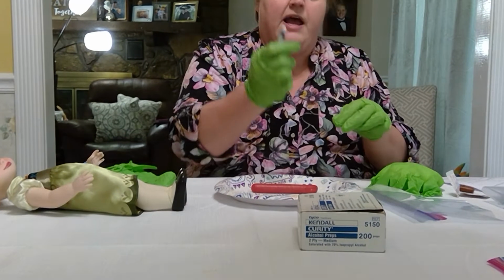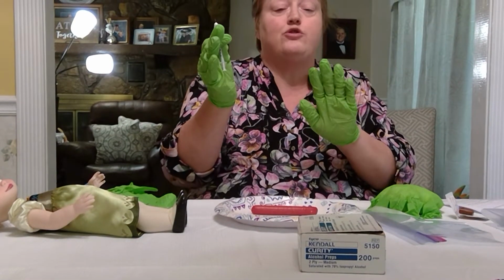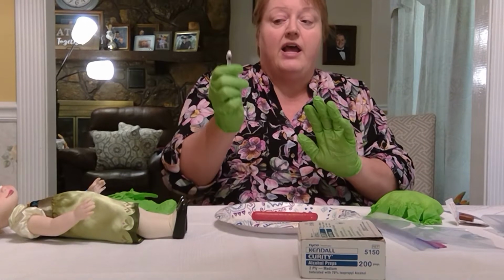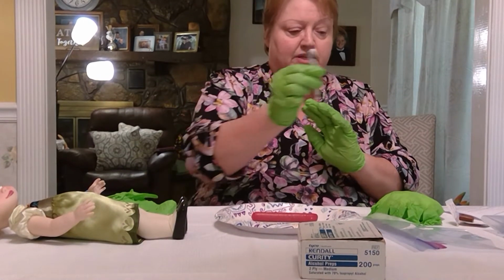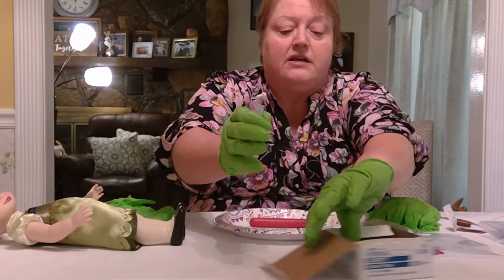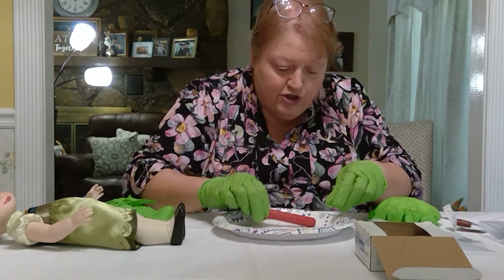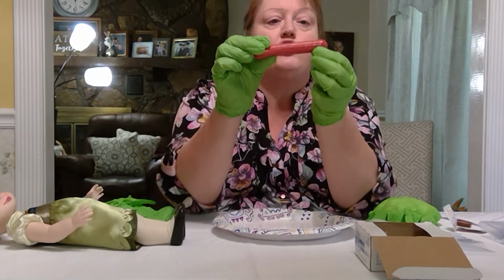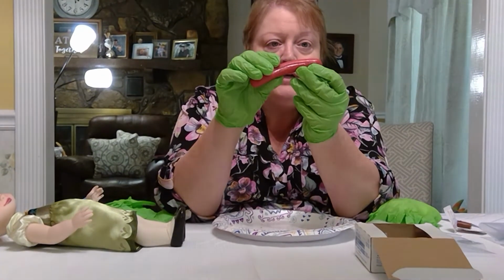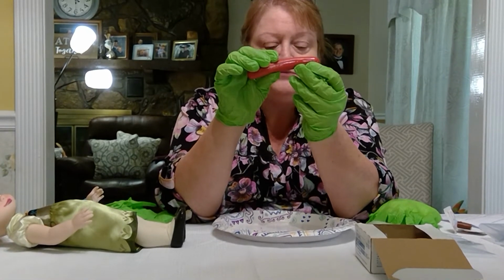Remove. Activate. And because you're going to be practicing this repeatedly, and we want you to save all of your injectable medications for next semester, say activate, don't actually do it, and then dispose of it into something that you have made to be a needle box. Then I want you to pick up and demonstrate to me, show me the wheal that you have developed. And it should be a little lump in the skin, and a wheal should be developed if you injected it correctly.